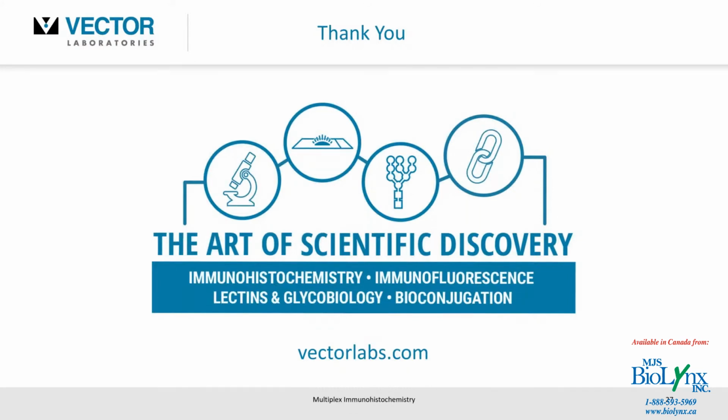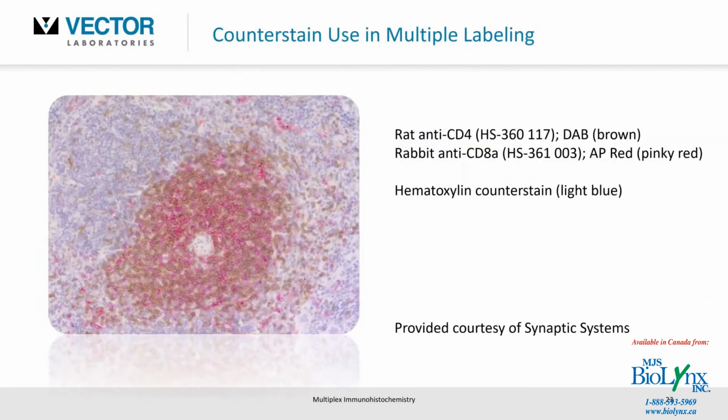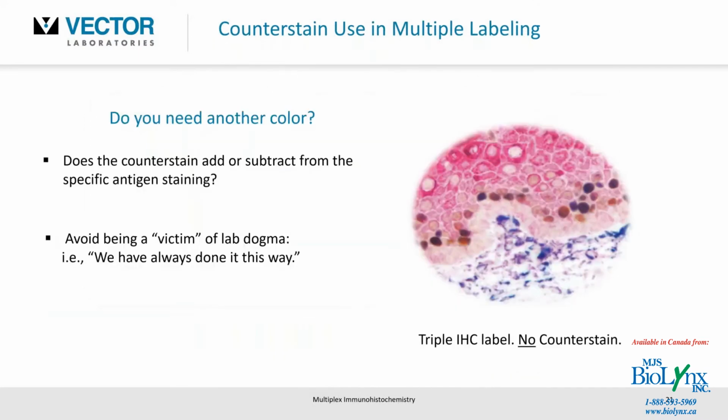So I did provide some examples of nuclear staining. Well, there's one for BrdU, and I'll go back here. So here was a triple label, hopefully you guys can see that. This is DAB triple label. This is the Ki67, a mitotic marker. So that particular image does indicate nuclear staining for a given target antigen in a triple label.